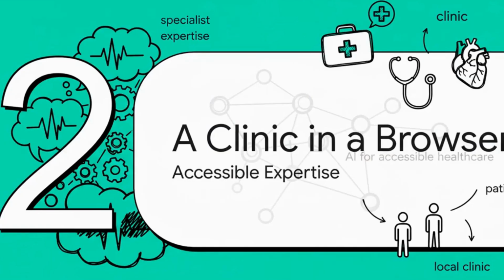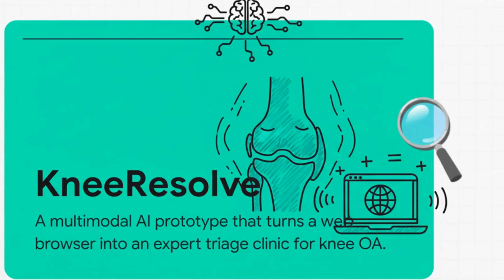But what if you could change all that? What if you could take all the knowledge of a top specialist and put it directly into the hands of a local clinic, or maybe even the patient themselves? I mean, what if you could build an entire clinic right inside a web browser? Well, that is exactly what KneeResolve sets out to do.